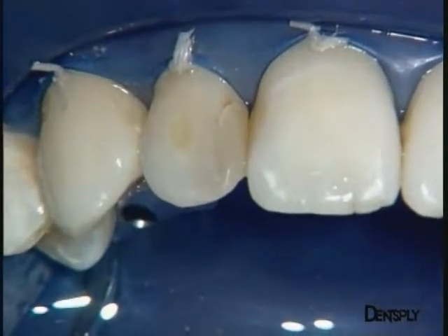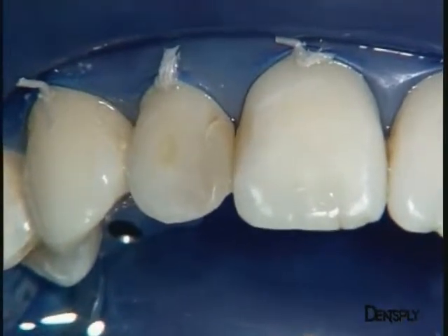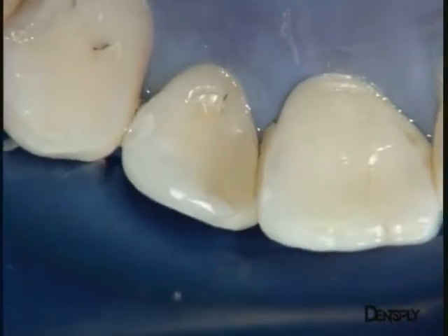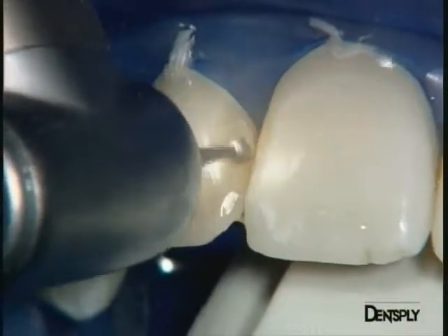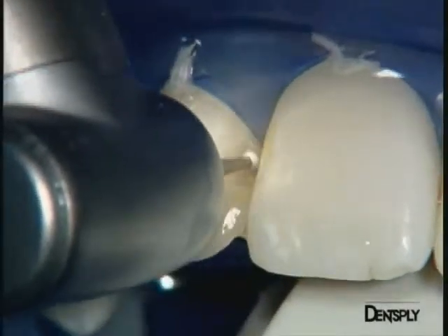Once the rubber dam has been placed, the old restoration is removed. We can also see that the restoration on the central incisor will need retouching. The old restoration is removed with a diamond ball burr, with spray of course, starting with the bulk of the lateral incisor.